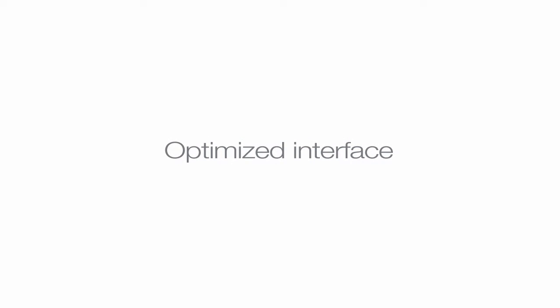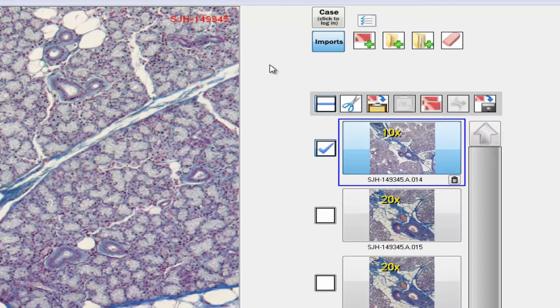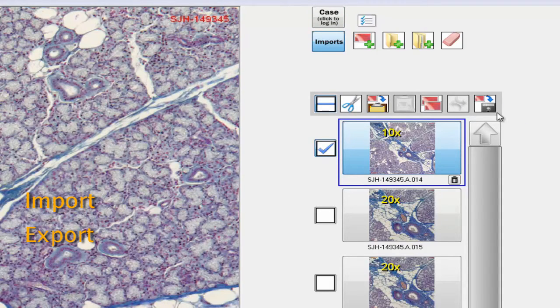PassSuite's optimized archive interface automates image saving to your IT file server as well as your LIS database. Additionally, PassSuite provides image import, export, and autocopy functions, allowing for easy management and sharing of your images.